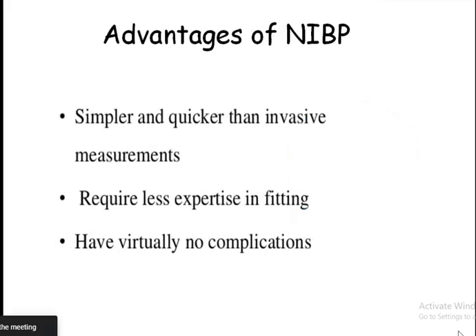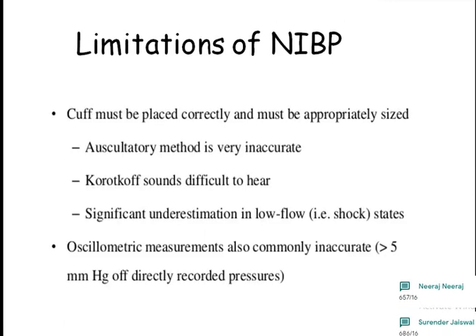Now these are the advantages. This is a simple method, and it can be done quickly. Nothing more is required, just a little expertise. Anyone can do it, even the nurses. You just need a little training and there are no complications. But these methods are accurate only if the patient is stable and not very sick.